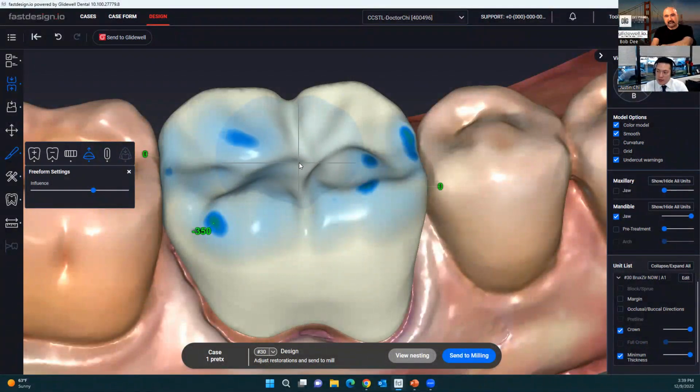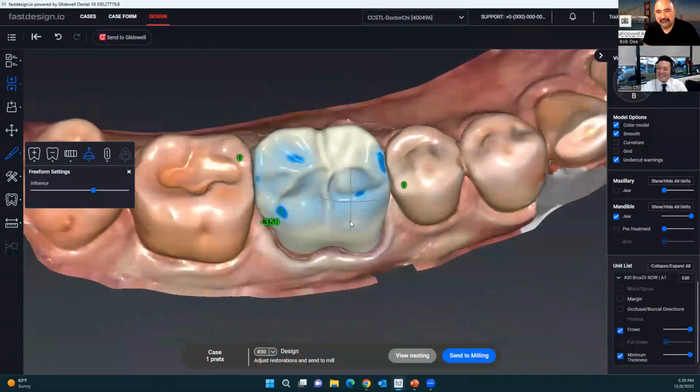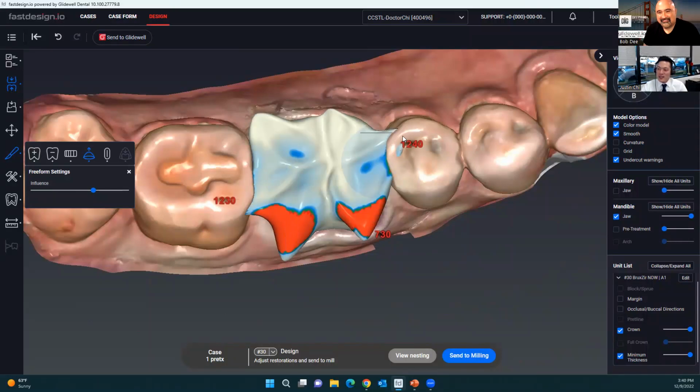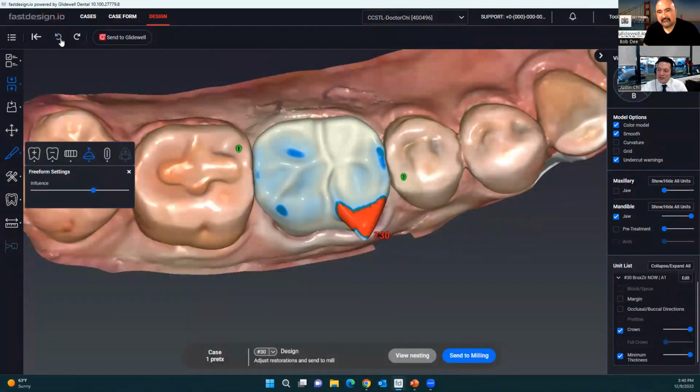So it does have some warnings within the design to notify you of any critical changes that can affect the outcome of your case. And also there is a back button on the upper left corner. So just in case you mess up, you can press the back button and it goes back. Another really good one. So let's say you get a little out of control, and you're playing around, and what happens a lot is, as you're learning the mouse movements, you might accidentally pull something way off. As Bob said, you have the undo, which all great softwares have, to just get you right back to a safe spot. Right.